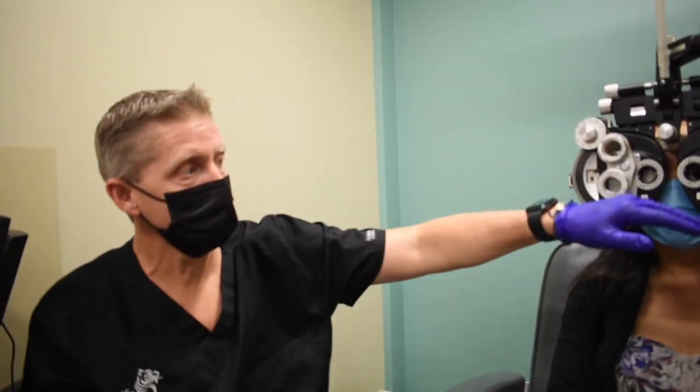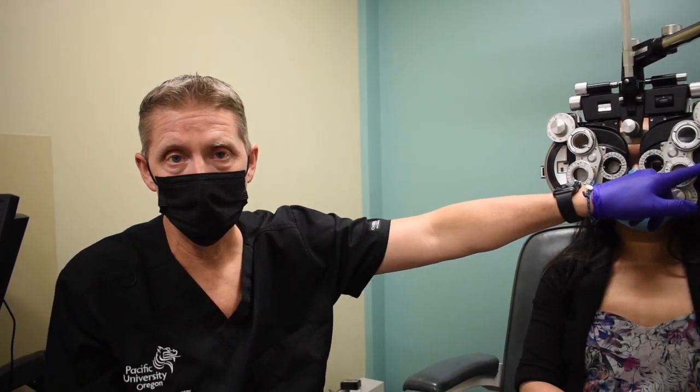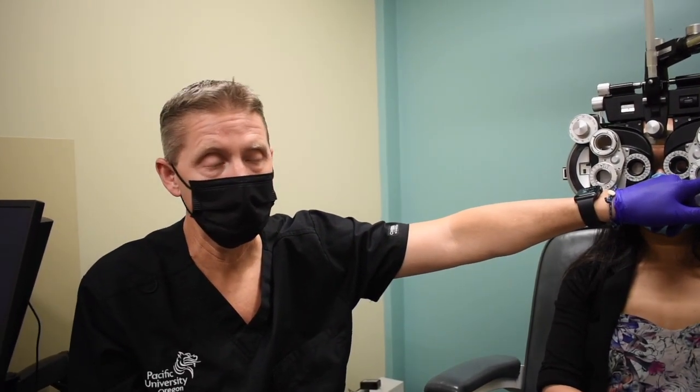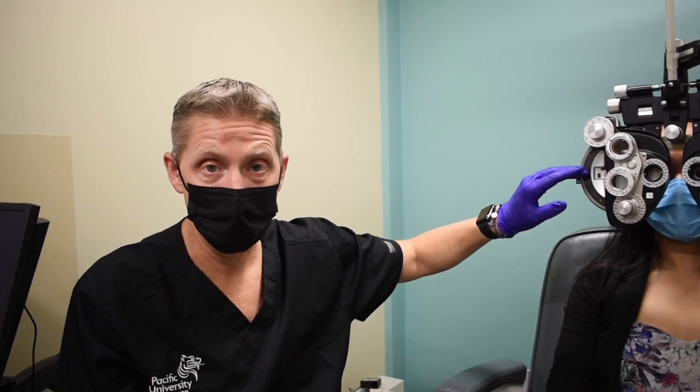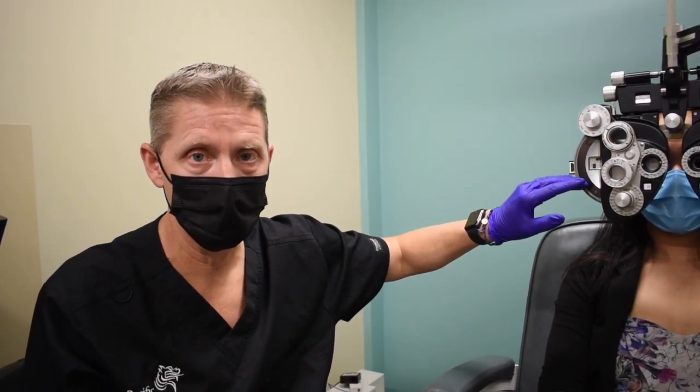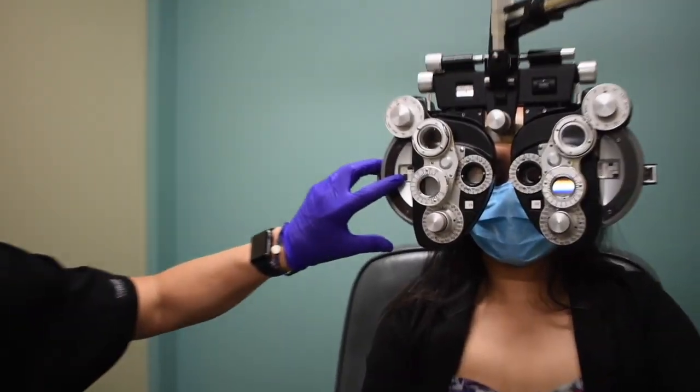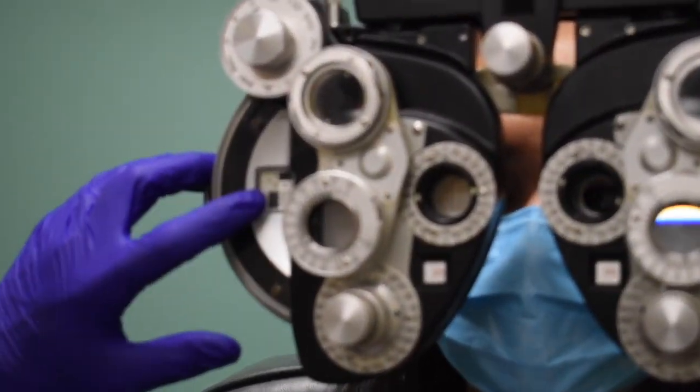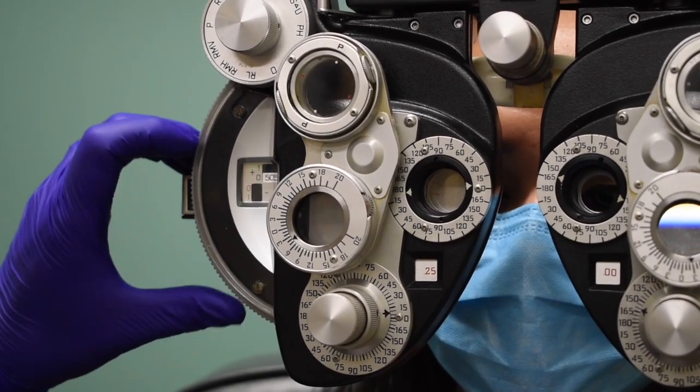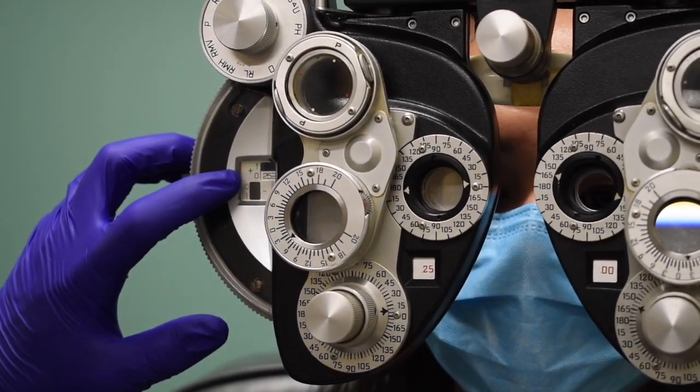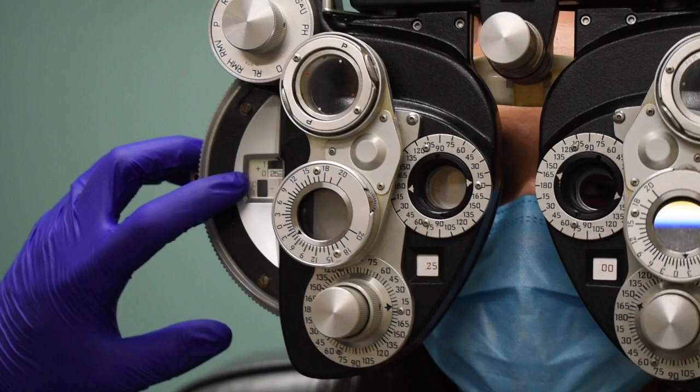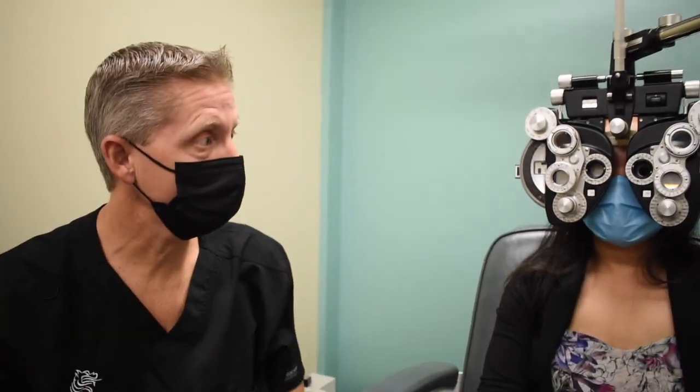Just to reiterate, when we go from red to green, you'll take visual acuities through the green lens. You'll record the green lens. On this eye, we had one equal, so we went red equal green. You would record the equal, which is going to be plus a half. You would take visual acuities through the equal, which is plus a half. But you would leave the plus a quarter lens or the green lens in place. Okay? So that gets you through your bichrome.